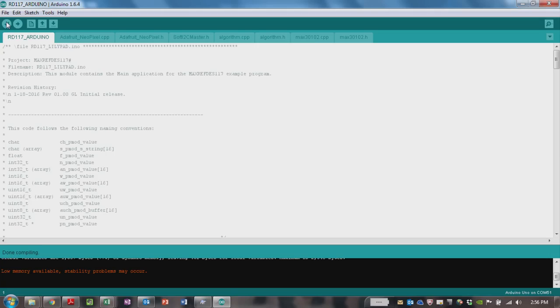We've compiled the code. I notice we get a message here. It says low memory available. Do we need to worry about that? No, that's fine. The code is fully tested. Does the code use up a lot of memory? Yes, definitely. The algorithm uses a lot of memory because the more data you can store in memory, that means longer periods of heartbeat data, which helps the algorithm calculate the heart rate more accurately.